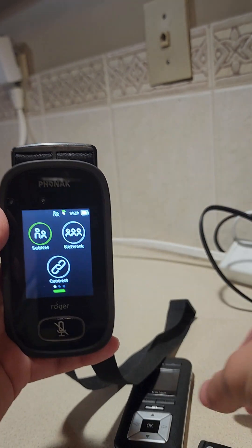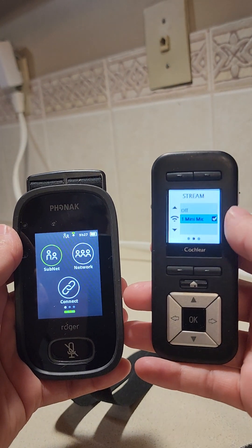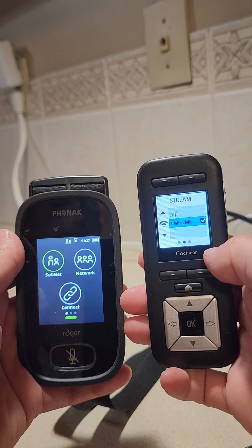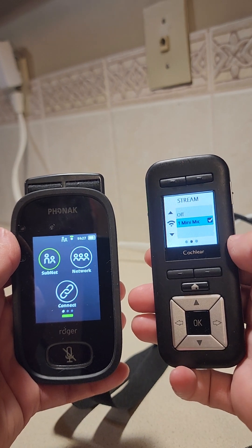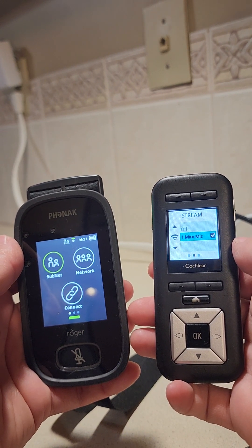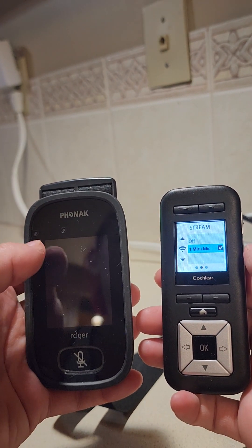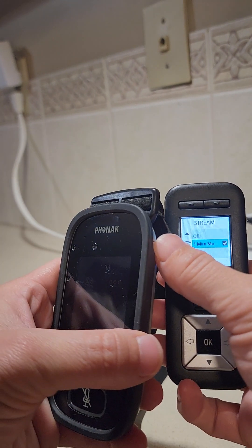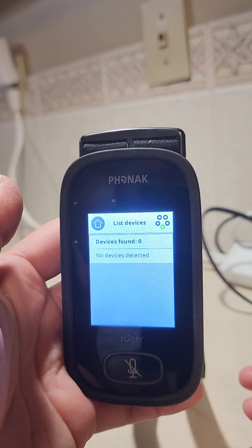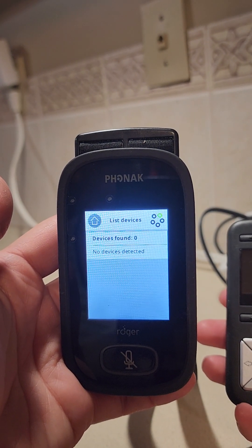The only other thing that could be wrong when troubleshooting is going back to the remote assistant and making sure that the Mini Mic is actually turned on. The processor right now — that little error at the bottom — wasn't connected, and as my kid turns his head because he's sleeping, sometimes that gets knocked off. To make sure it is connected, you can go to list devices and that should show that it is connected.